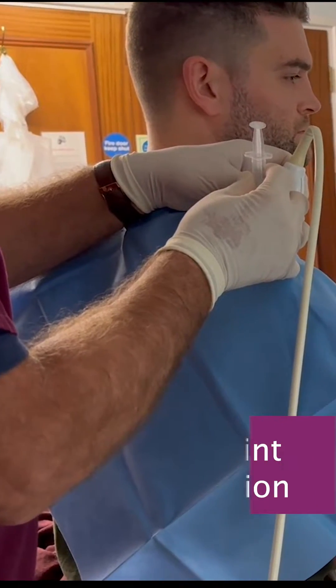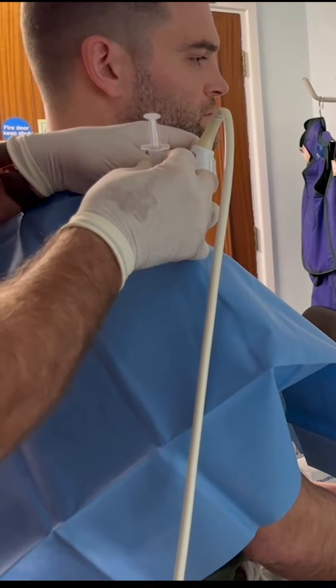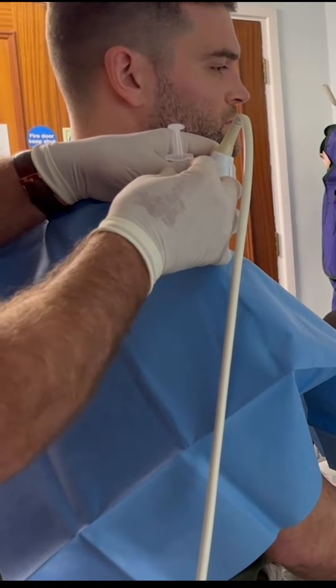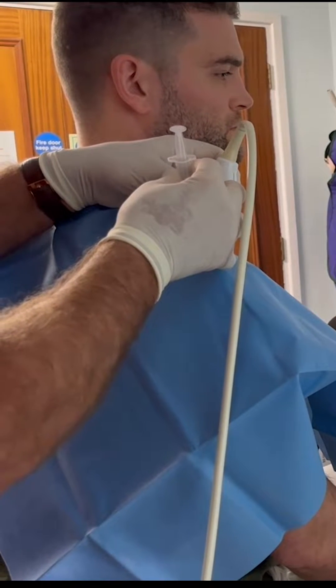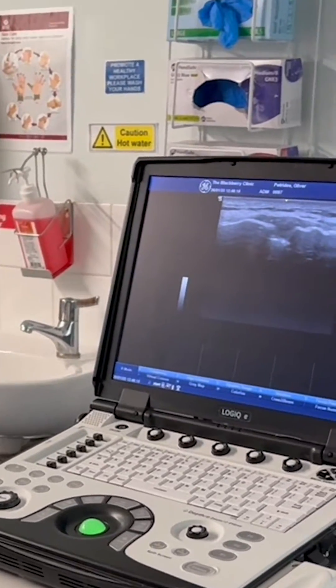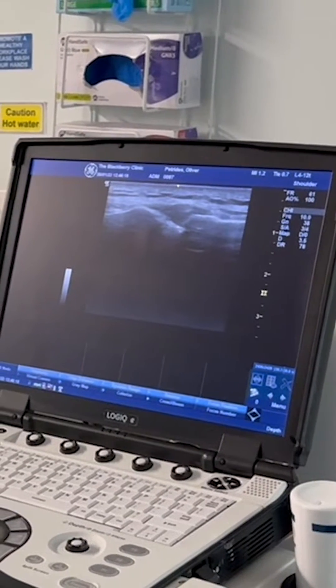I'm performing an injection for a recurrent AC joint pain in a rugby player who is suffering from pain and inflammation around the acromioclavicular joint on an annual basis, often in the middle of the rugby season.